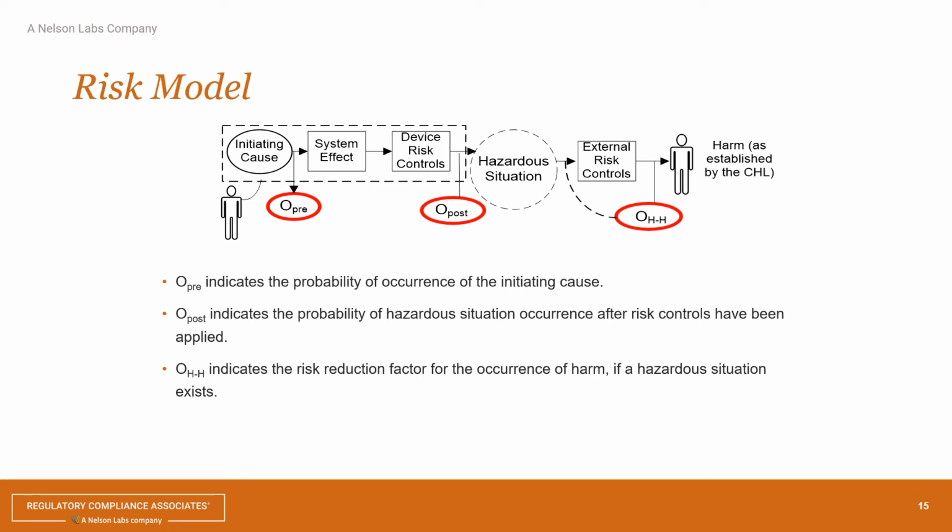So I talked a little bit about risk model, and software risk management is a little bit different than hardware risk management, because software issues and problems are systemic problems, and because they're systemic problems, typically frequency of occurrence is assumed to be 100%. I've seen it too much where people have frequency of occurrence and they're using it incorrectly just because they transferred the stuff from hardware to software.